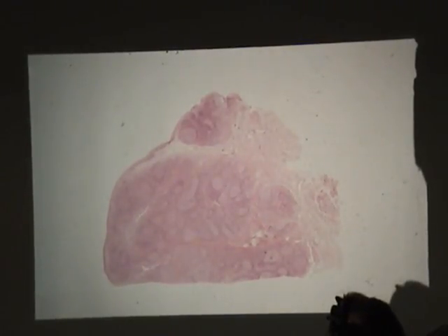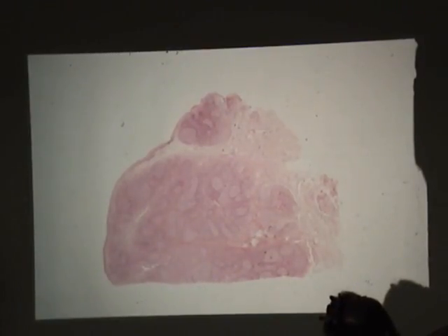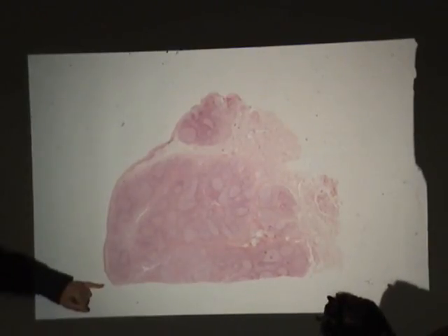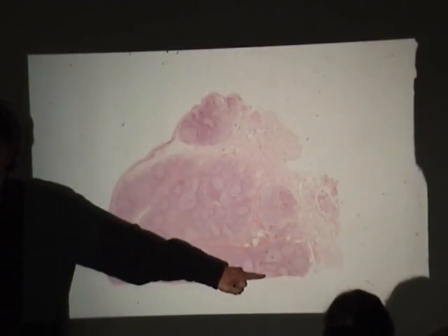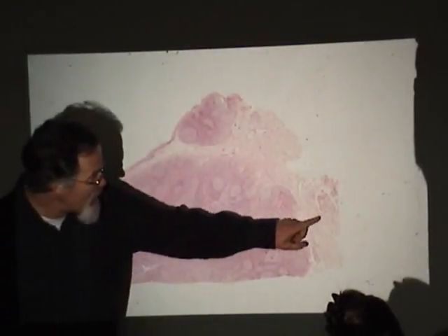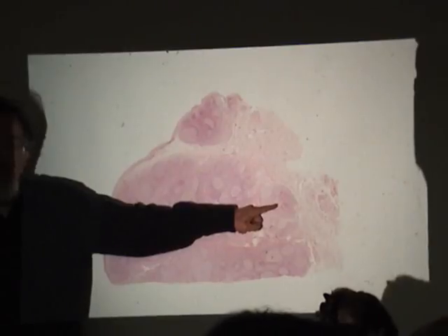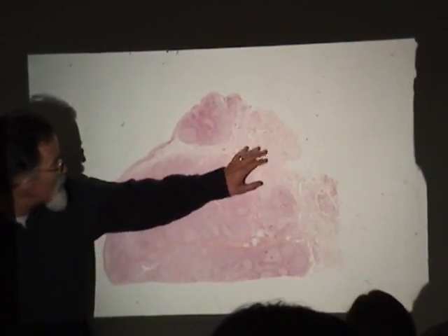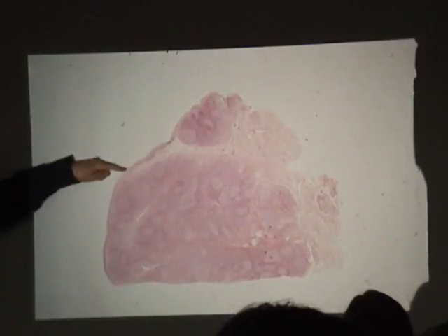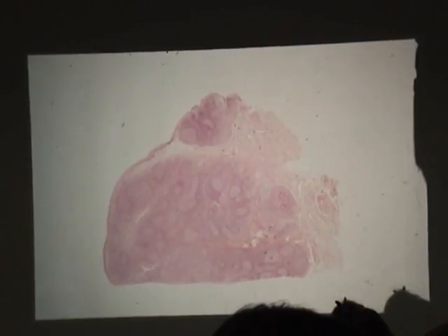When you do that, you get all sorts of impressions. With this palate and tonsil here, one of the things you've got to figure out is what's a cut surface and what's an epithelial surface. Well, this is clearly a cut surface. Look, we sliced these secondary follicles in half. Here we start to pick up connective tissue, might have a bit of mucus gland. Not surprising, your pharynx produces a lot of mucus. But we here see this connective tissue. And then we come up here and it looks clearly like an epithelial surface. You do that circumnavigation, you'd be surprised how much stuff you've got in your head. Then you go to the higher powers if you need to. Please keep that in mind as you do the exam.